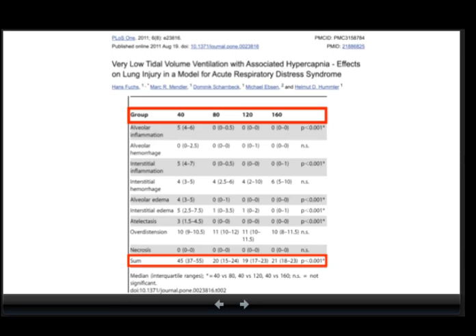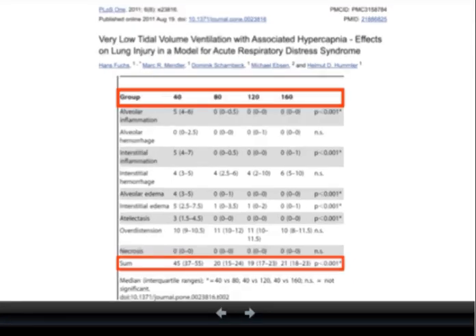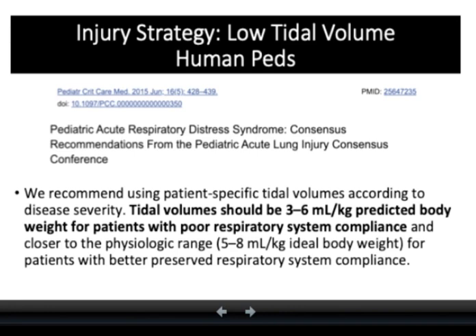They concluded that ventilation with low tidal volumes and associated hypercapnia was lung protective. A tidal volume below 4 to 5 mL per kg did not increase lung protection in this surfactant deficiency model. However, even at extremely low tidal volumes in association with severe hypercapnia, lung protection and oxygenation were maintained. Pediatric intensivists who ventilate kids with body weights as low as 2 to 3 kilograms use the tidal volume similar to adult humans.